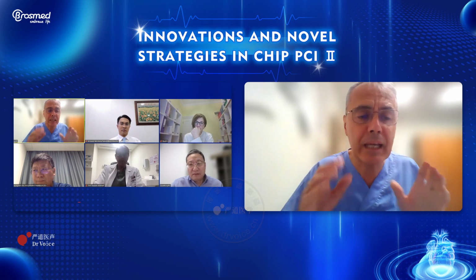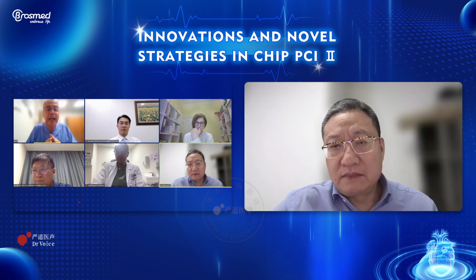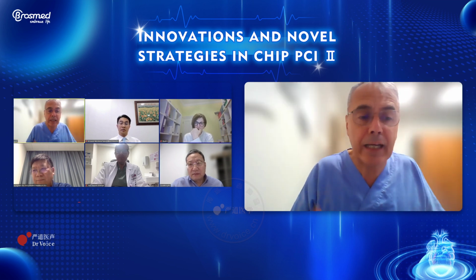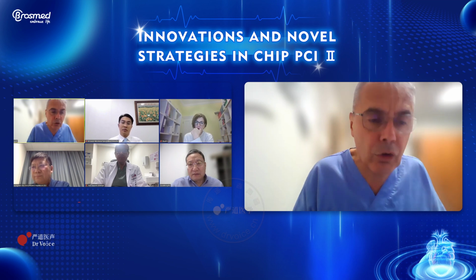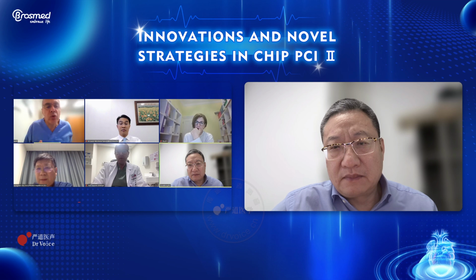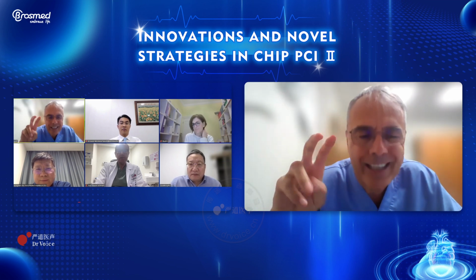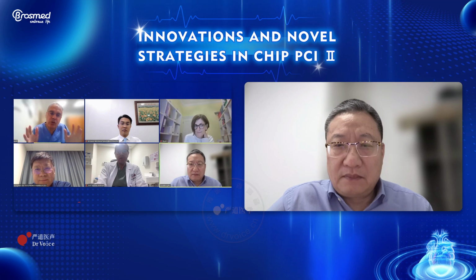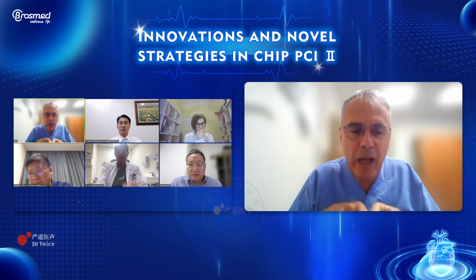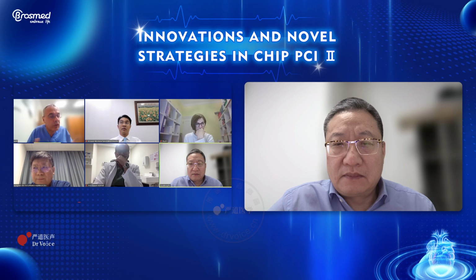Second point is the independent wiring, not fixed on the balloon, and it's better for refolding and also reopening to recross a lot of times. Sometimes if you use a cutting balloon, we cross, and then if you want to cross another time, it's not possible, especially in bifurcation. It's similar to scoring because we go with the wire. In the case with the LAD and diagonal, I have a 2-wire and another 3-wire around, but we cross very well.